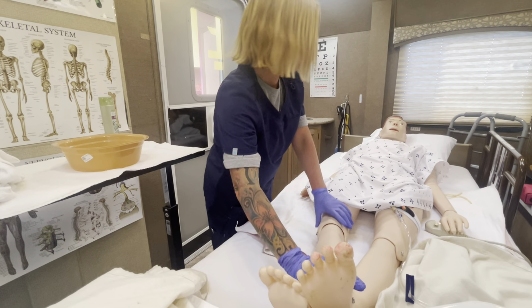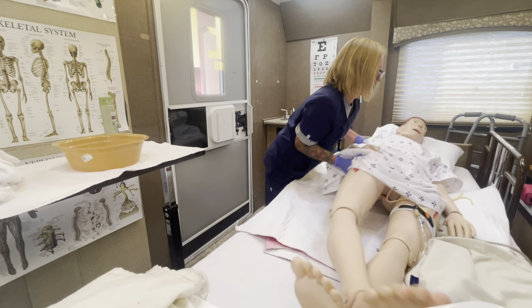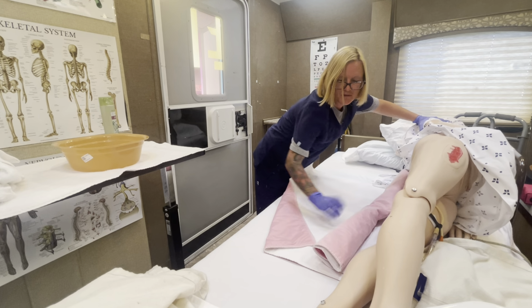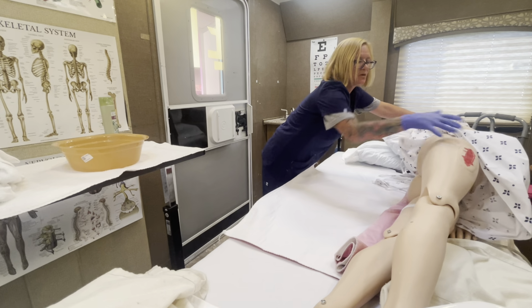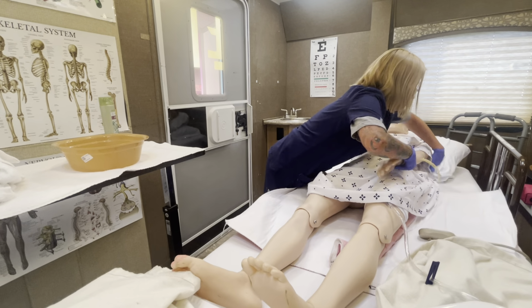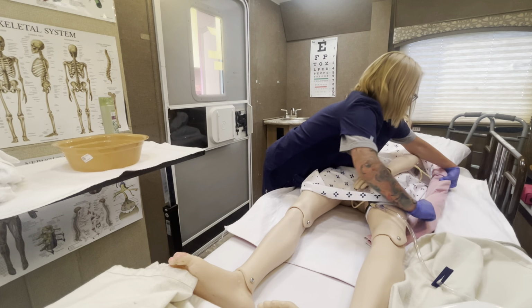All right, so I'm going to cross her legs, grab at her shoulder and hip, roll her up. I'm going to roll the pad in, just the one that I was using. Remember, this one was already here. I'm going to tuck, again, just like I did before. I'm going to roll the patient back over, and I'm going to roll this way, just barely, to go ahead and get the pad out.